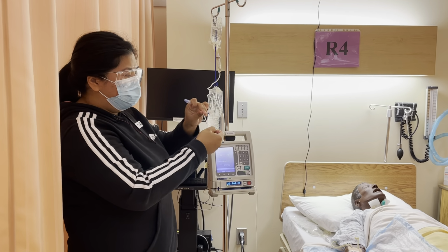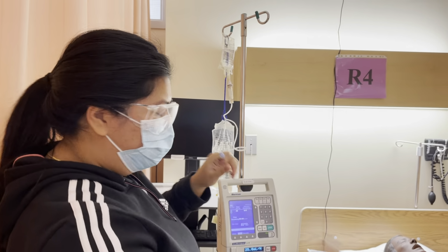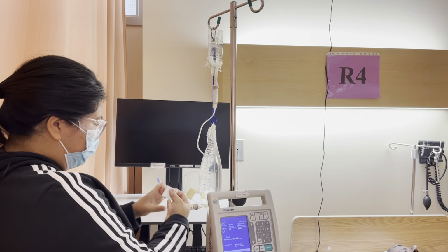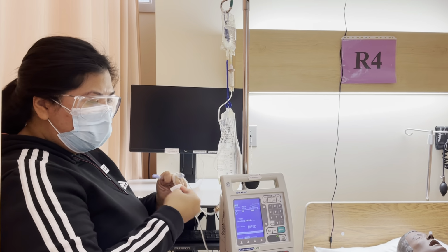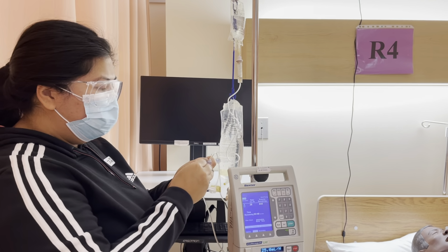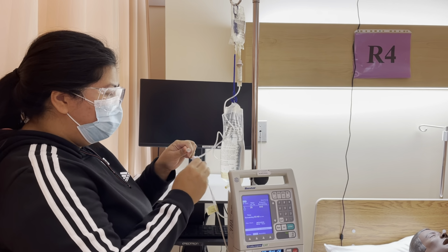We want to connect to the port that's above the pump. That way it can be regulated by the pump. It is an antibiotic, and the time and frequency we're giving it is now. So we'll give it a swab for 30, let it dry for 15. We'll connect our secondary tubing.